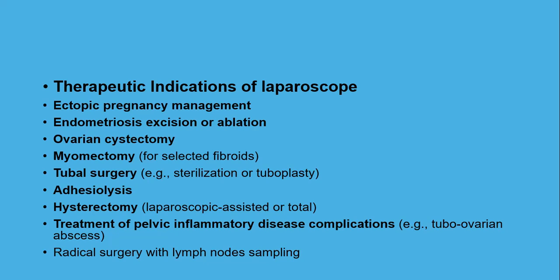Therapeutic indications of laparoscopy. Ectopic pregnancy management. Endometriosis excision or ablation. Ovarian cystectomy. Myomectomy, for selected fibroids. Tubal surgery, for example sterilization or tuboplasty. Adhesiolysis. Hysterectomy, laparoscopic assisted or total. Treatment of pelvic inflammatory disease complications, for example tubo-ovarian abscess. Radical surgery with lymph node sampling.